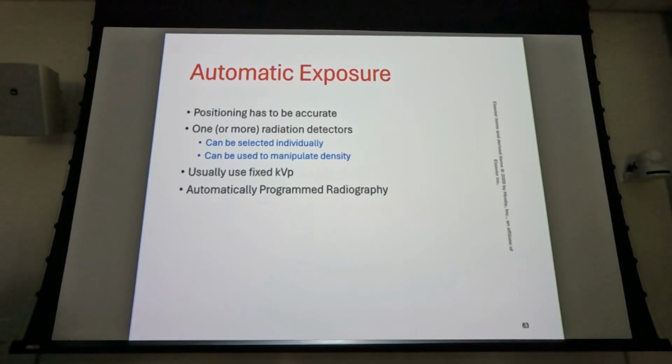I used to work in a hospital where our processing used water. It came into the system and they didn't control the temperature of the water. In summertime, we had to use less radiation than in wintertime because in the summertime the water was hotter. So anyway, it's kind of complicated. What we had to do if we were going to phototime something like a chest x-ray is, in the wintertime when the water was colder and our films would come out light, we'd use all 3 cells for chest x-ray.